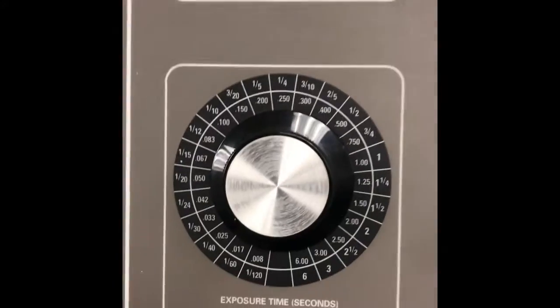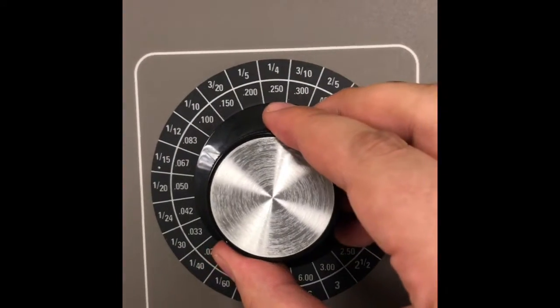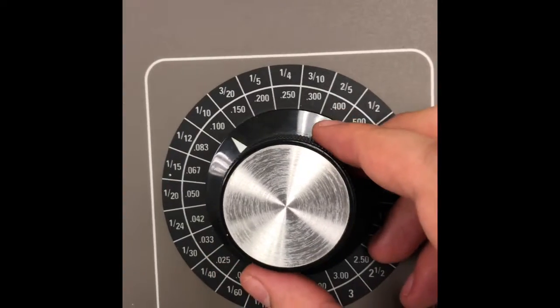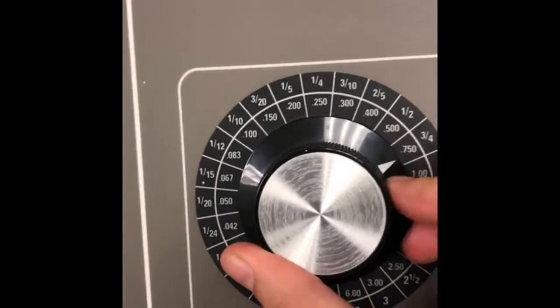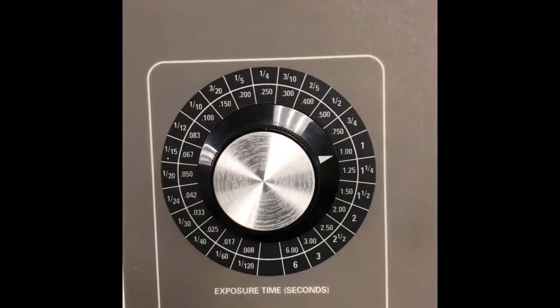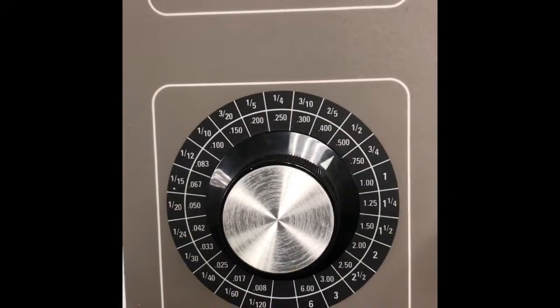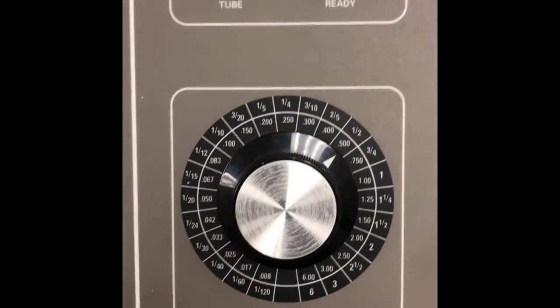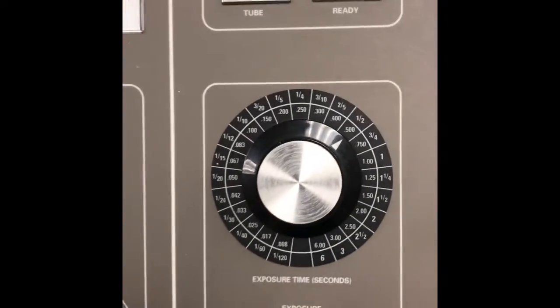Over here you can see you have your timer. You could select from 1/10 of a second, 1/5 of a second, all the way to 1 second, which is the example I gave you on the board. And this determines the length of the exposure, so it stops the exposure once the amount of time has been reached.